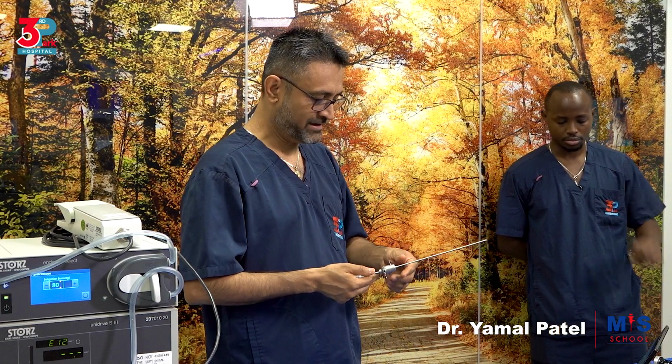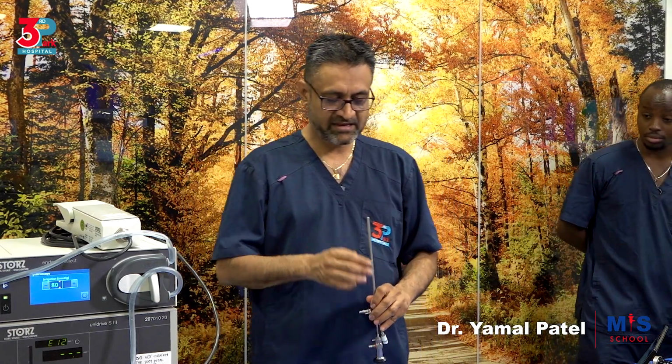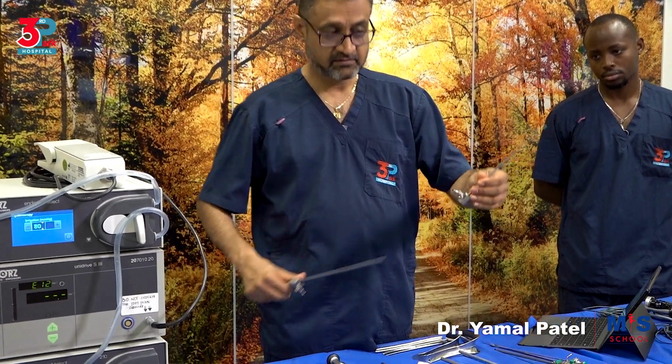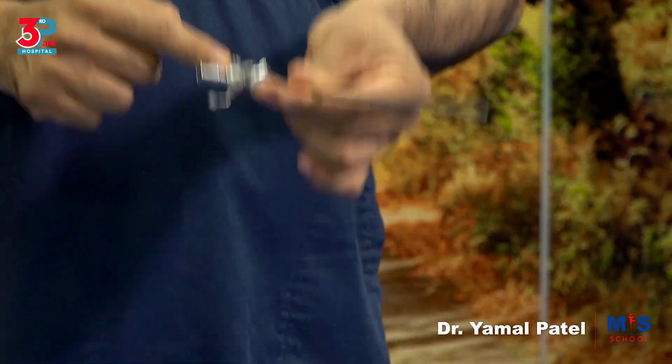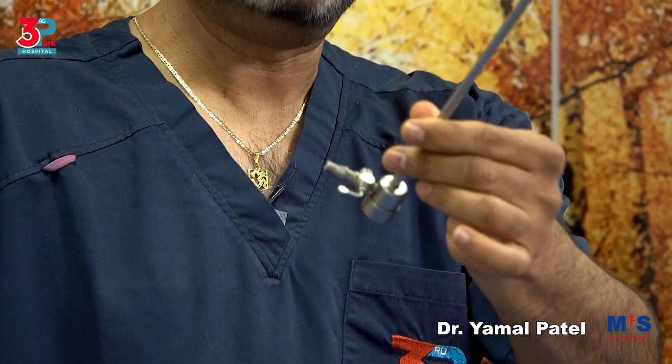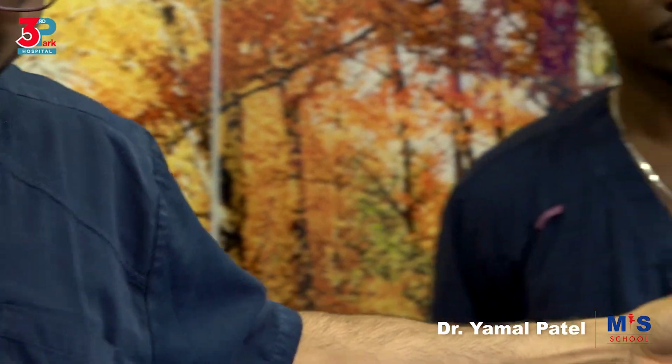Now, how do you define this? This is a continuous flow, operative, diagnostic hysteroscope. So it has mainly two channels. We have the one channel that is in the outer sheath. If you can see this, this outer sheath has some fenestrations here, and it has one channel with one connection here for the outflow. So you can hold this.